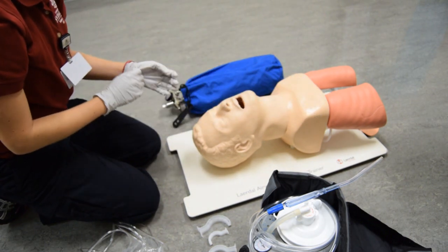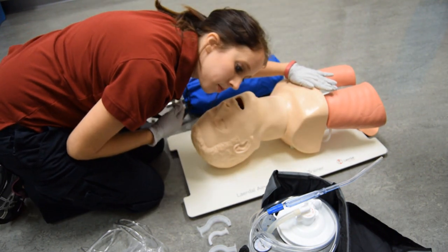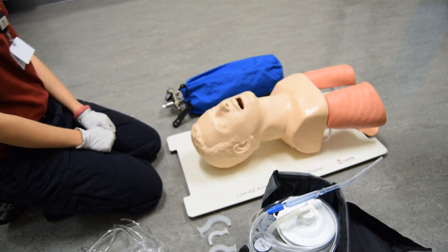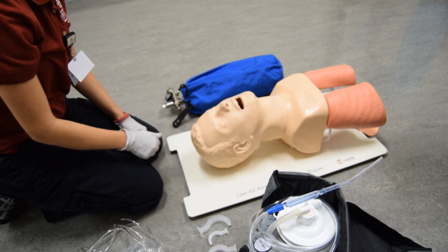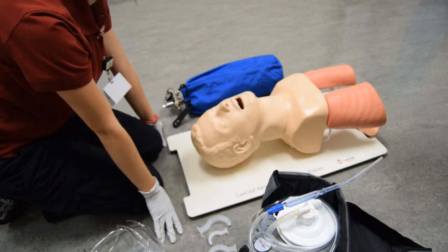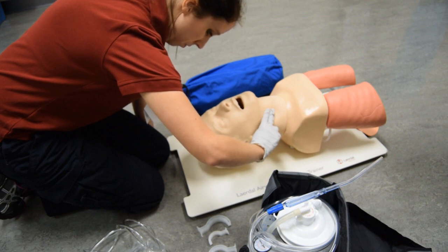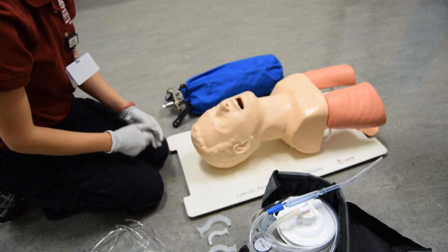Checks responsiveness and checks breathing. The patient is unresponsive and apneic. The student must now request additional EMS assistance. I'm going to need to request additional EMS assistance. Checks pulse for at least five seconds but no more than ten seconds. You palpate a weak carotid pulse at a rate of 60.